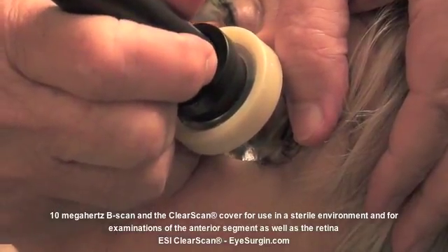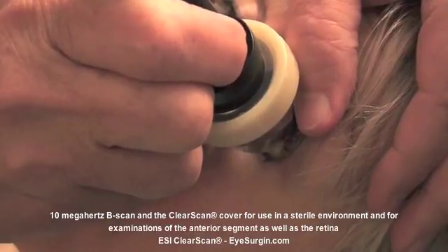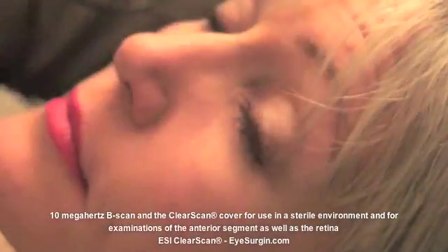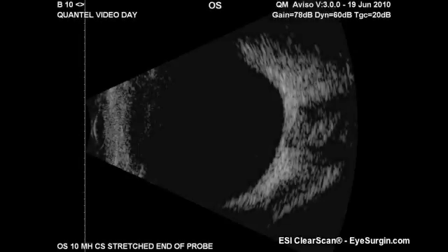With the patient fixating on my finger, we can readily see the cornea, the iris, and the posterior capsule of the lens if the tip of the Clear Scan is directly centered on the cornea. Note that the end of the bag is rolling off the ocular plane and presents as a vertical line on the screen.